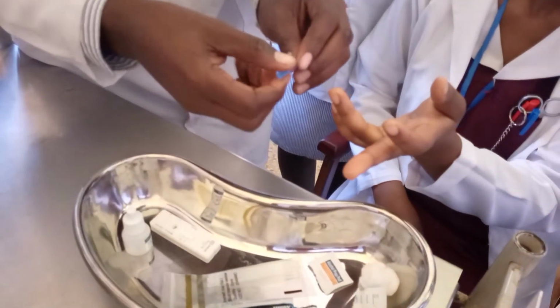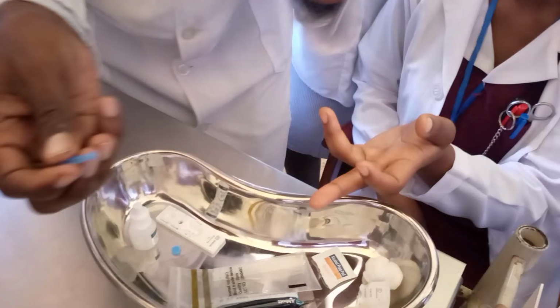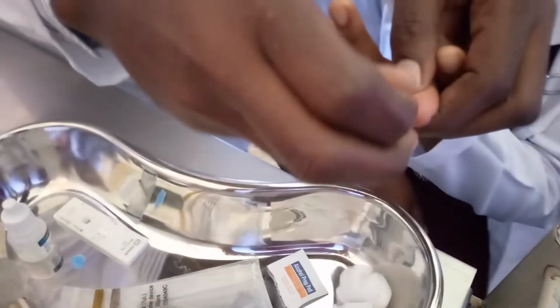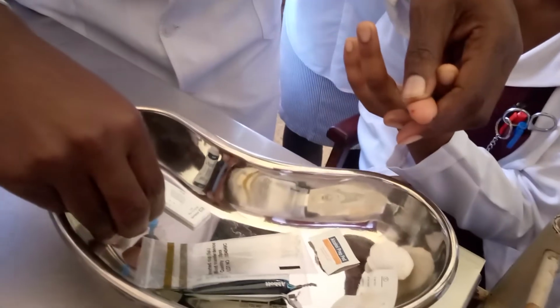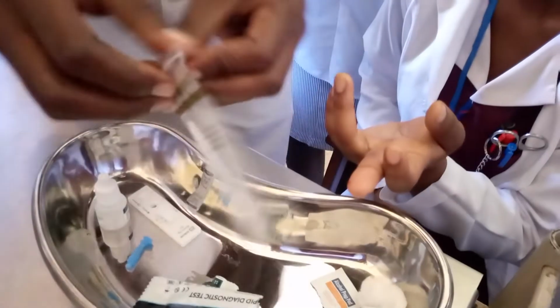So I'll be able to prick you. It will be a little bit painful, but just more like a sting. You go there, and don't go in the middle because there is a bone there. Go on the side so that you avoid that bone. Just go on the side there. As you can see, I pricked. Then you get this inverted cup.